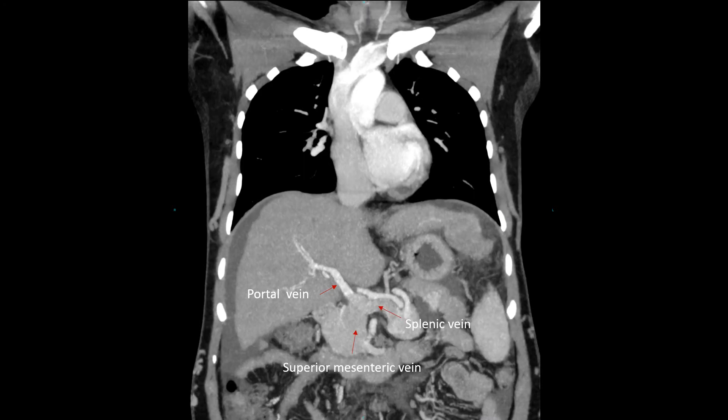The retrograde portal vein flow and the arterial-portal shunting at the lesions is very well demonstrated on coronal thin maximal intensity projections. Here we appreciate the difference in CT density of contrast agent in the portal vein versus the splenic vein and superior mesenteric vein, which tells us for sure that we are dealing with retrograde flow in the portal vein.